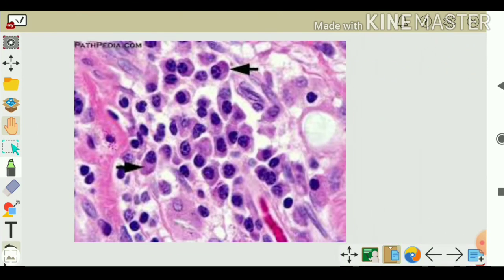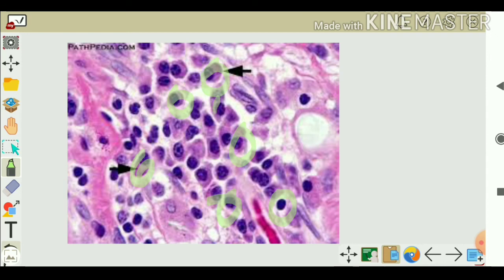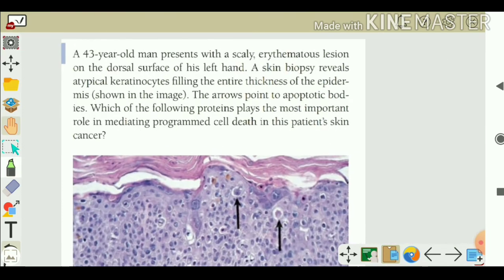And in this image you can again see the plasma cell, a second plasma cell, and we can find a lymphocyte, and here we can see the macrophage, lymphocyte, plasma cells. Okay, so this is the plasma cells and lymphocytes histology. So let's go through the next MCQ.